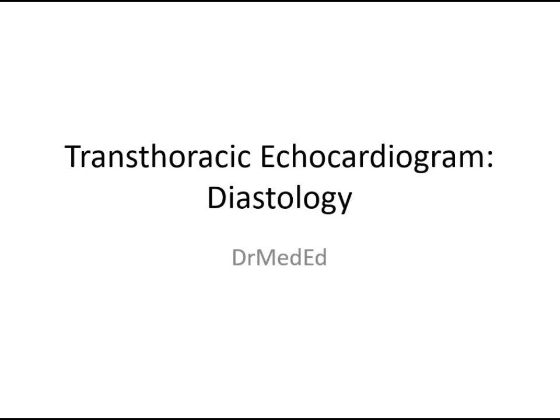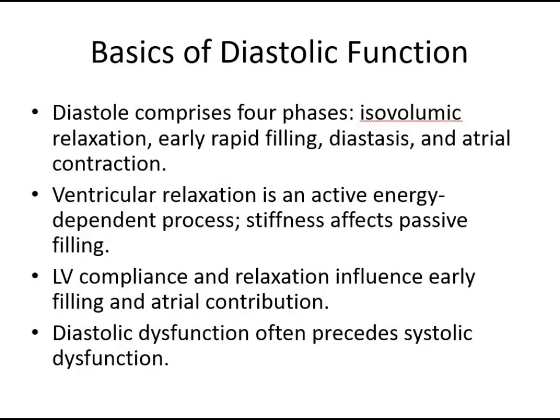Today we're diving into a detailed guide to understand diastology and transthoracic echocardiogram. Let's start with the basics. Diastology has four phases: isovolumic relaxation, early rapid filling, diastasis, and atrial contraction.